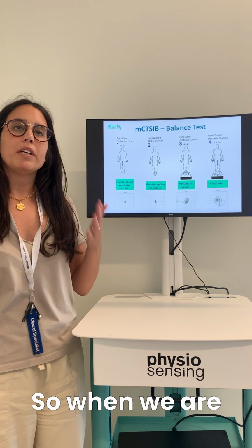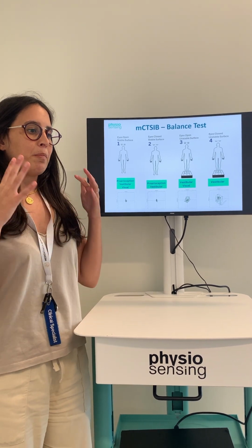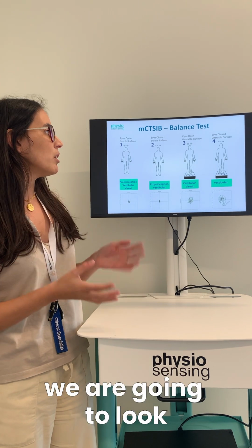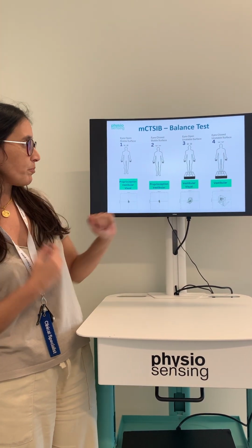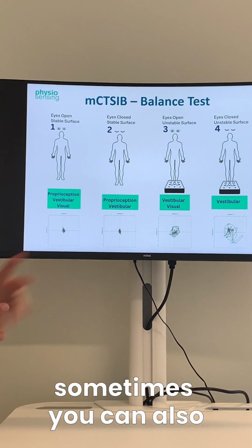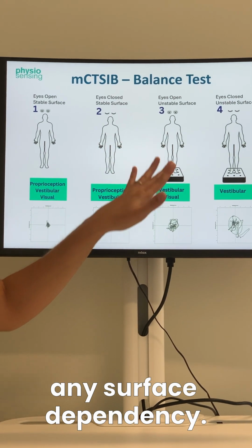So when we are assessing patients that look like they might have a vestibular dysfunction, we are going to look into the results of this fourth condition. And on the third, sometimes you can also understand if there's any surface dependency.